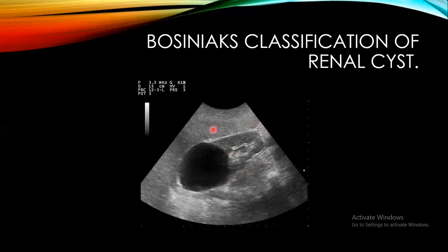So when we see a cyst like this within the kidney by ultrasound, and as I said, those cysts are usually discovered accidentally or incidentally by ultrasound, when you see a cyst like this, we have to reassure the patient.